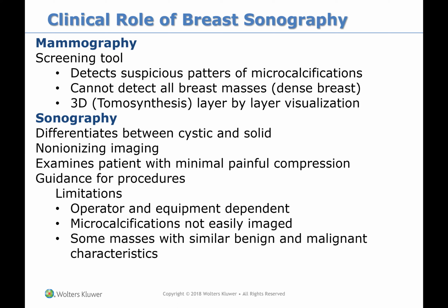The limitations are operator and equipment dependent. More seasoned techs can find more than a person that is just starting out. Microcalcifications are not as easily seen as on mammo, and some masses have similar benign and malignant characteristics.